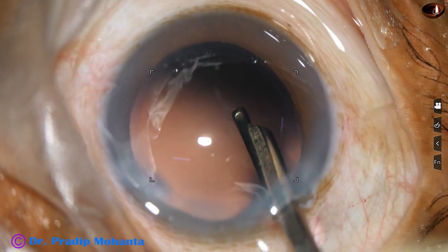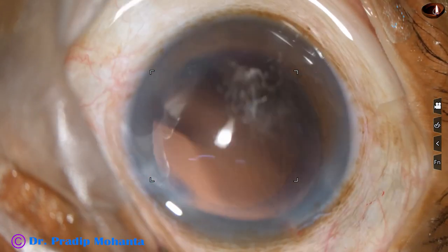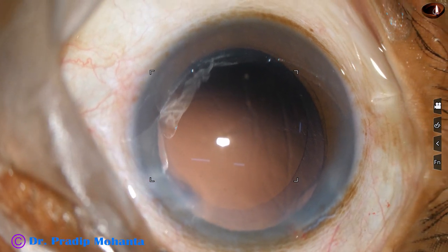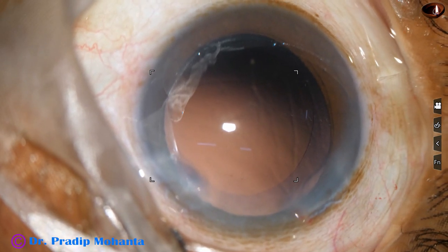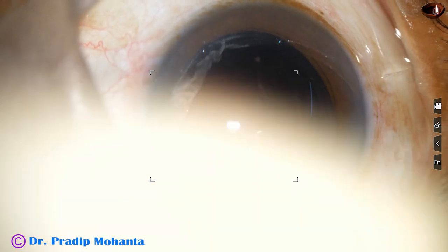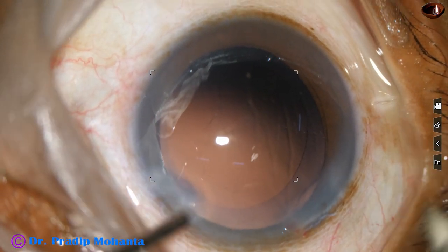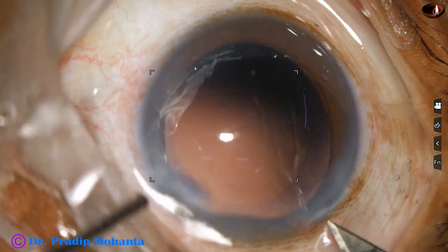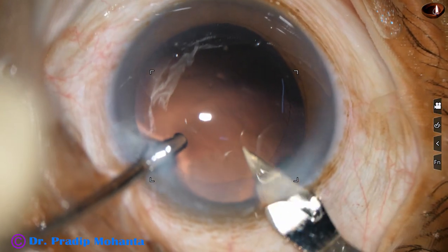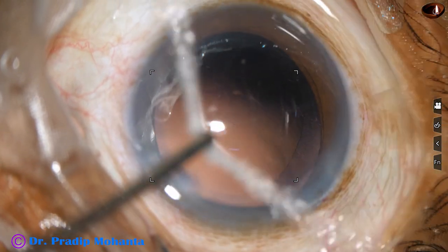There is only one side port, 90 degrees away from the main wound. So the astigmatism produced by the main wound will be neutralized to some extent by the side port. The main wound is enlarged a little bit because I'm going to use a B cartridge.